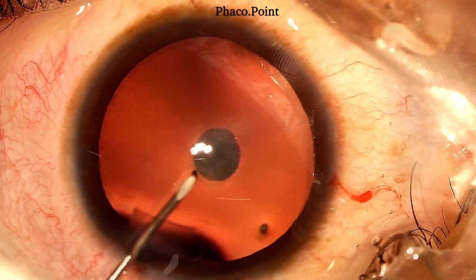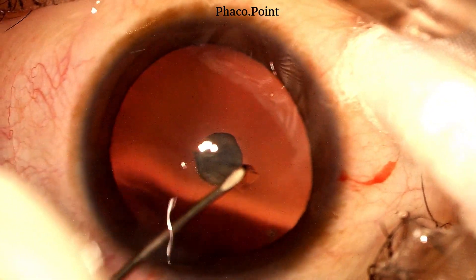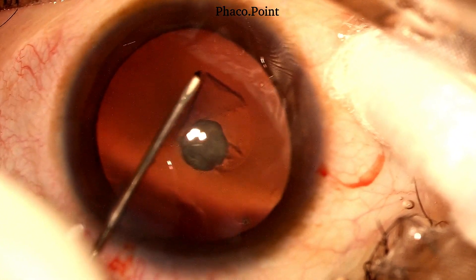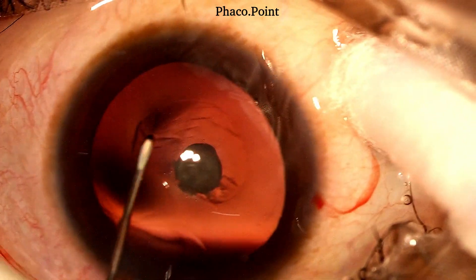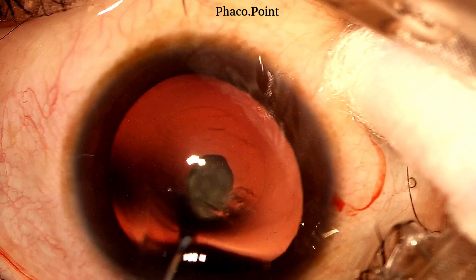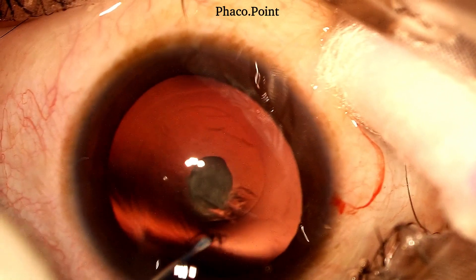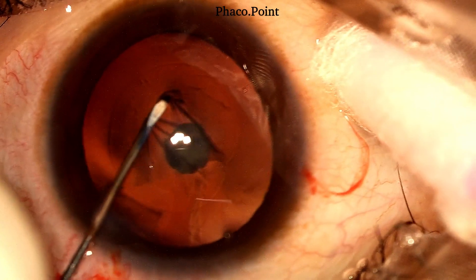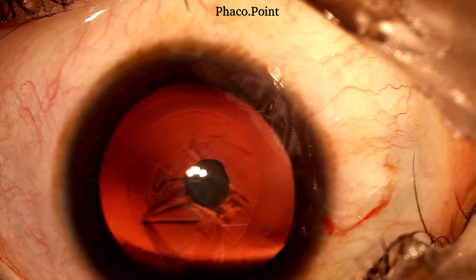I tend to perform my capsulorhexis always through the main incision, but it's very important that whilst doing so, do not press on the posterior lip of the wound, because that causes the visco to egress out through one of the incisions and results in shallowing of the anterior chamber. Note how I do it whereby I do not lose any viscoelastic whilst performing the capsulorhexis.